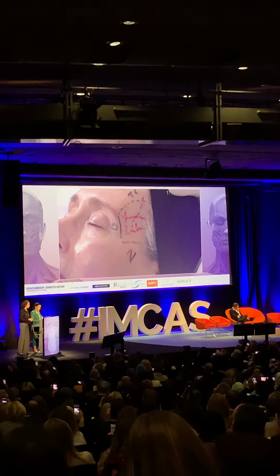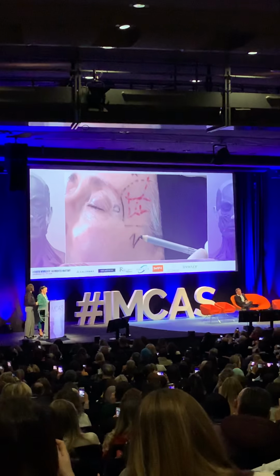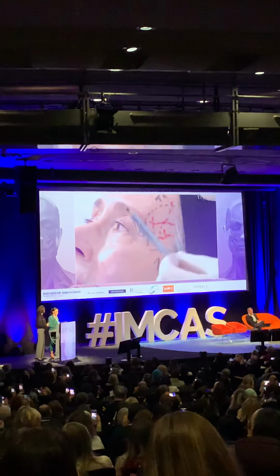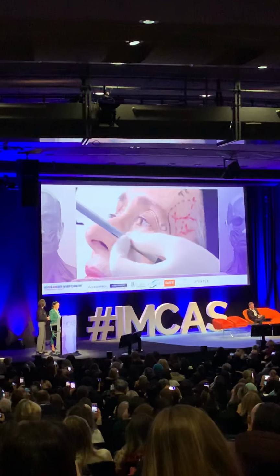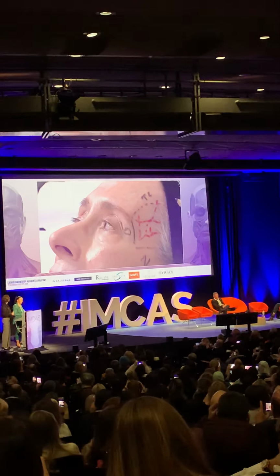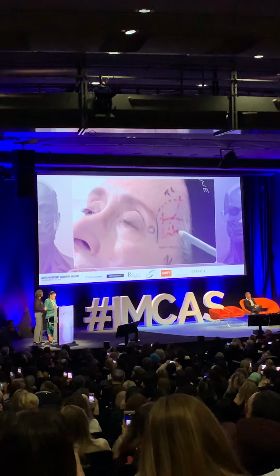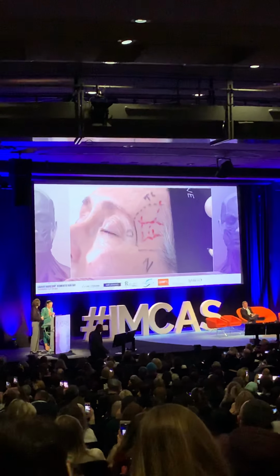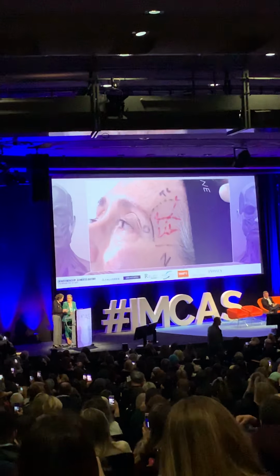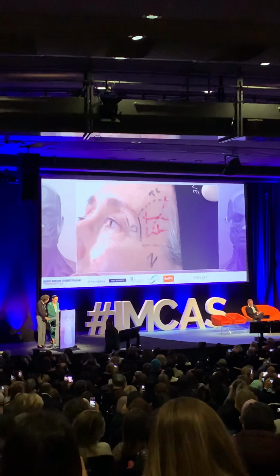Contraindication. She has a very good cheekbone here that you see with this Z, it's a zygoma. And all this area is okay, it's a good shape. But as you can see, there is a depression of the temple of these patients with a lot of shadows inside. And I mark on this patient on the left side, and I will do the injection on the right side, all the anatomical points that Jonathan developed in the cadaver lab.